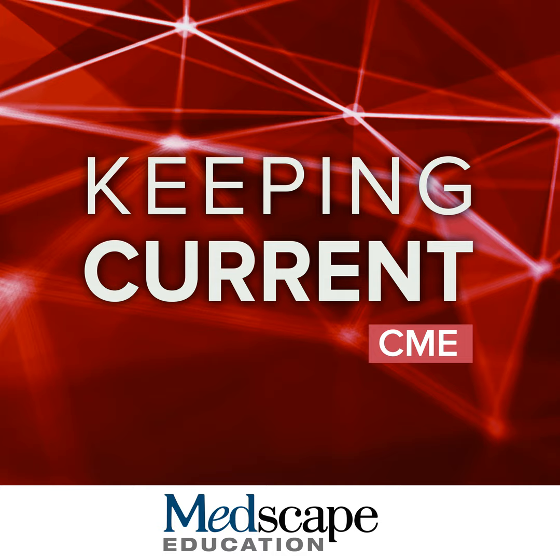In the acute phase, typically CT scans are the imaging modality that is most often used because they can be obtained very quickly. Also, some of those patients who have head trauma were involved in severe trauma that may have affected other regions of their body, their cervical spine, their thoracic or lumbar spine, their chest, their abdomen.